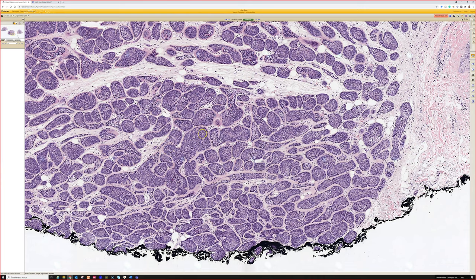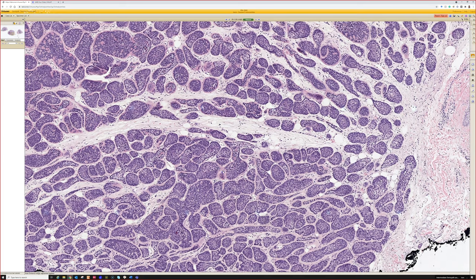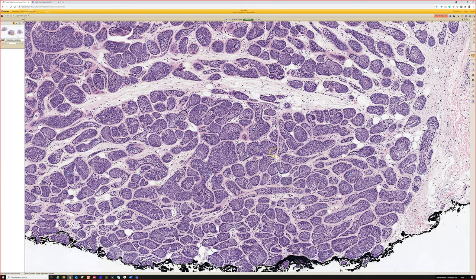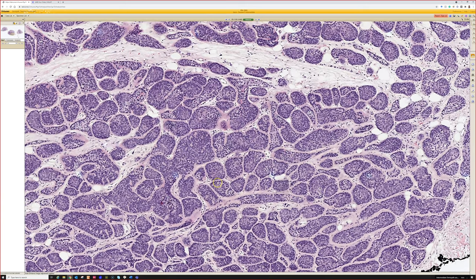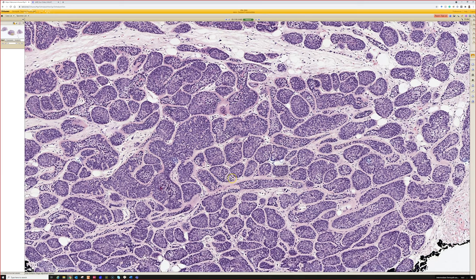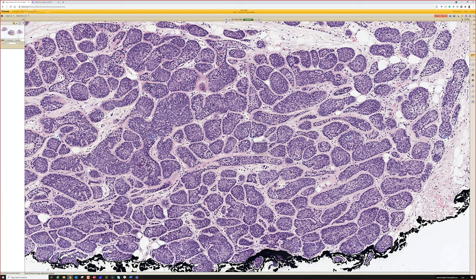My fellow Ed Fulton, several years ago, we wrote a paper about sweat gland and adnexal tumors. It's in Archives of Pathology. It's aimed at general pathologists and non-dermpaths. So I will put a link in the video description if you're watching this online. In any case, he had the really great analogy that these look kind of like the spots on giraffes. I really like that, and I don't think I've ever heard anyone else use that. So unless someone tells me otherwise, I'm going to say that's an Ed Fulton original. So thank you, Ed, for that. Ed's the same guy that came up with the ramen noodle sign. He had lots of great visual analogies.